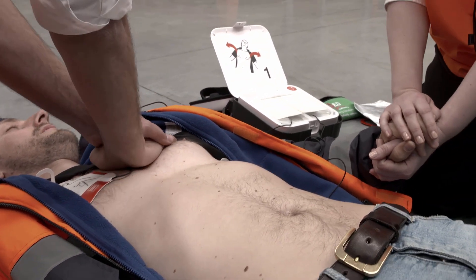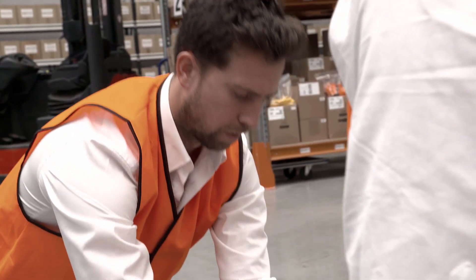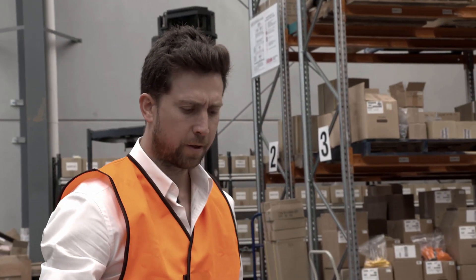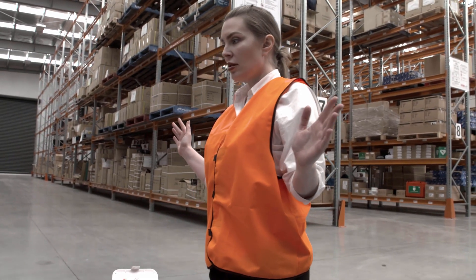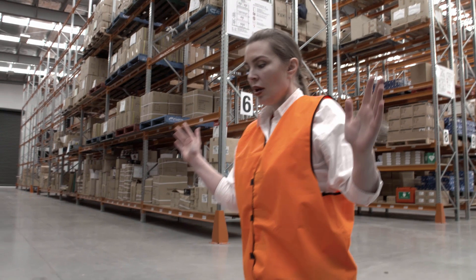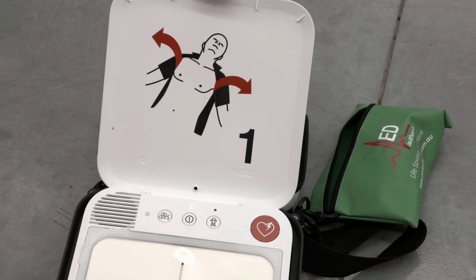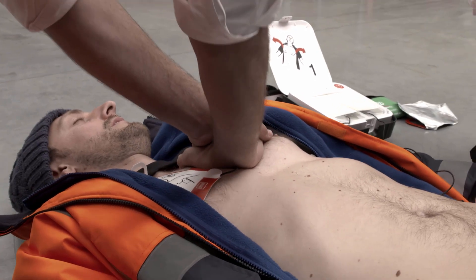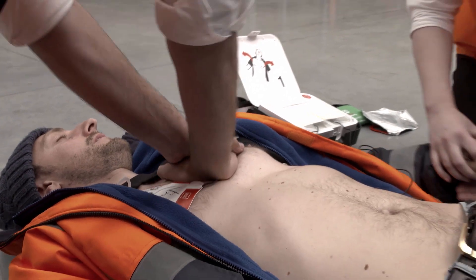When a shock is needed, the CR2 will advise everyone to stand clear and stop chest compressions. Everyone clear — do not touch the patient. Delivering shock. Shock delivered. Resume chest compressions and continue providing CPR until either the patient regains consciousness or emergency services arrive.